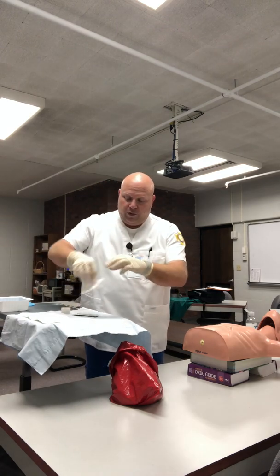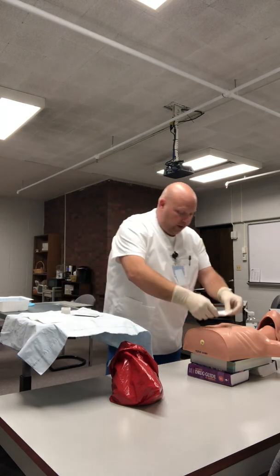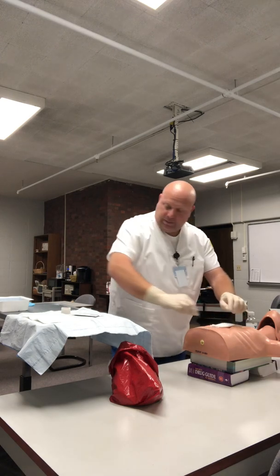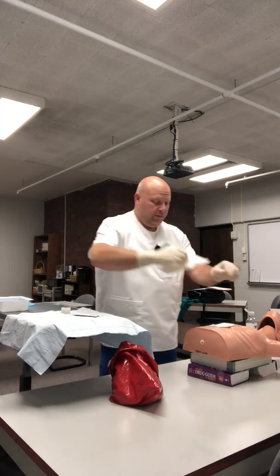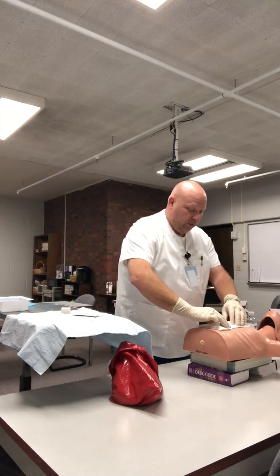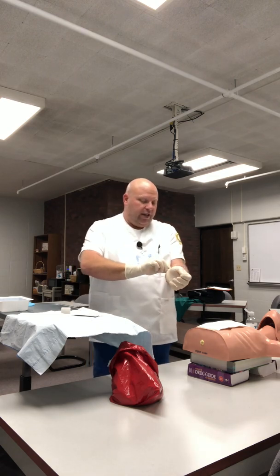I'm going to take my 4x4. I'm going to lay it right over the wound, just like that. I'm going to reach over with my ABD pad in the middle, blue line up. I'm going to place it over top of the wound. At this time, that wound is covered with a sterile dressing.